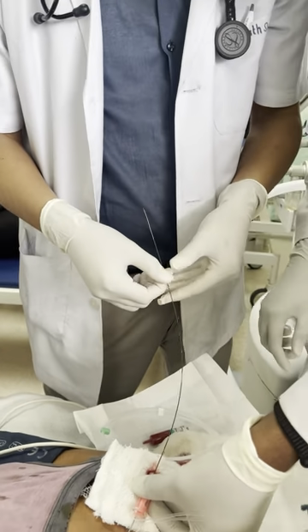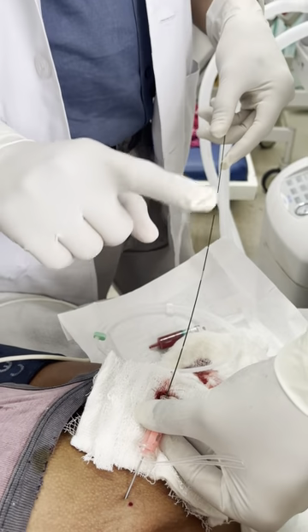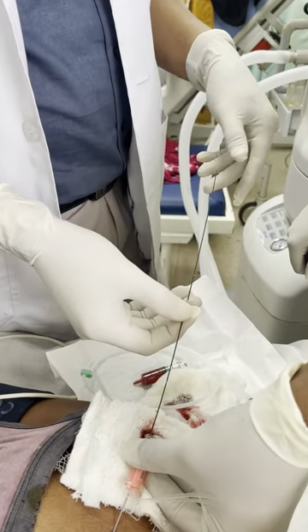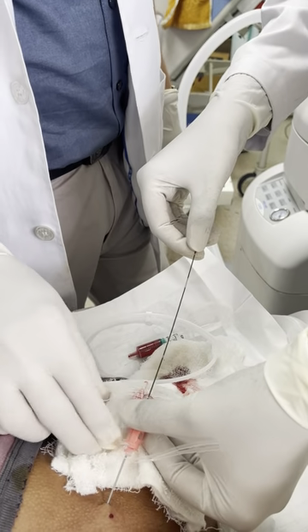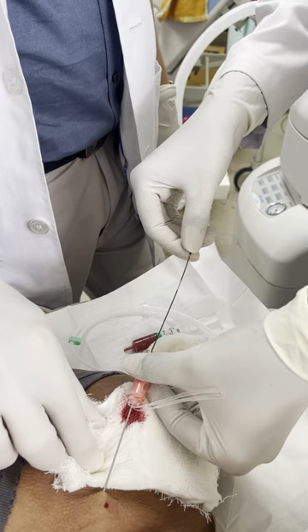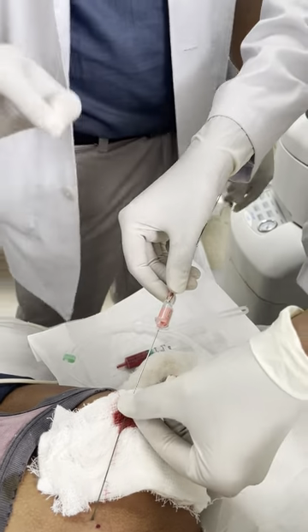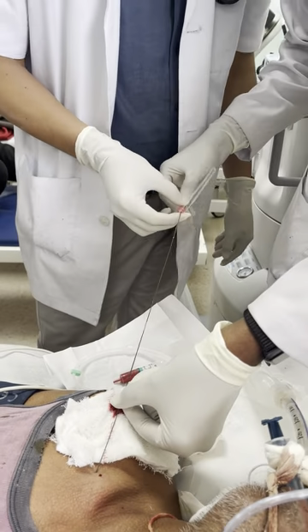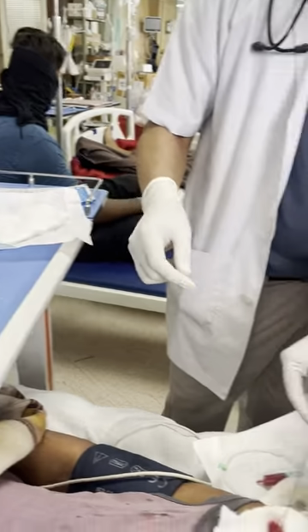This much is enough. Now what will you do? Holding the guide wire? No. You will remove the finder needle first. Hold the guide wire with your right hand. Remove the needle with the left hand. Very good. Remove it completely and keep it in a clean and safe place. And that seems to be this pond, the pond of heparinized normal saline.